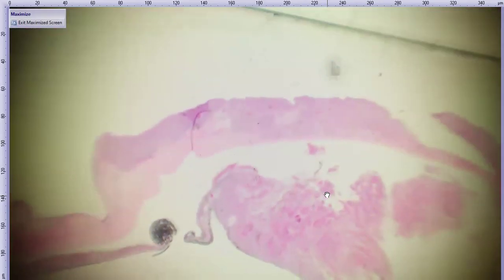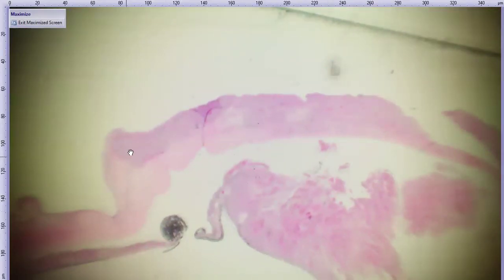All right. So up here is the cornea, you have the iris down here to orient you, and the little corpora nigra here, very cute. But we have the cornea up here, and there's all of this purple stuff that's eating up the superficial to mid, sometimes even deep corneal stroma. So really invasive. We have one tip of iris on this side, and then the rest of it's just being eaten by this tumor. We can see the similar tumor diving through the sclera. We can see it out here in the episclera. And we can see it all the way back down here, close to where the optic nerve is. So here's the optic nerve, here's tumor.